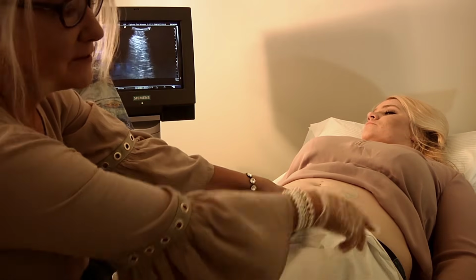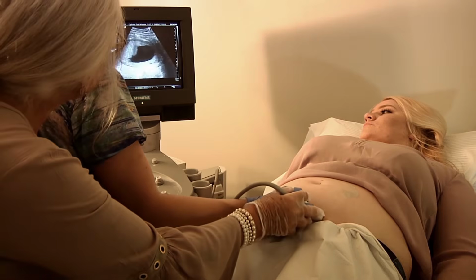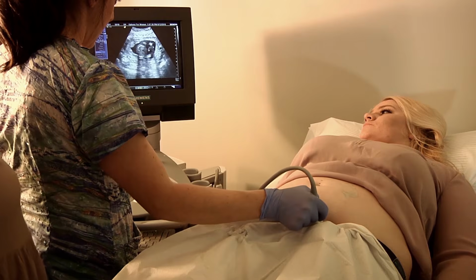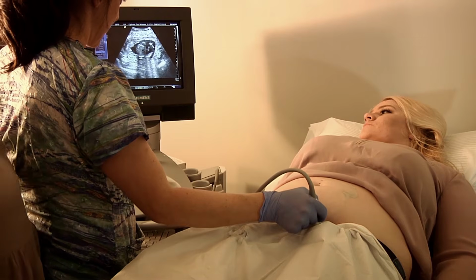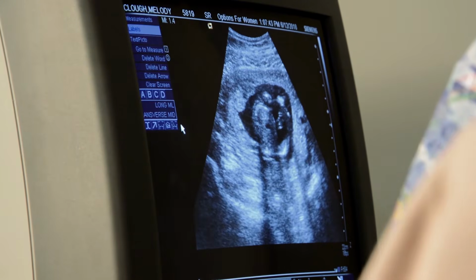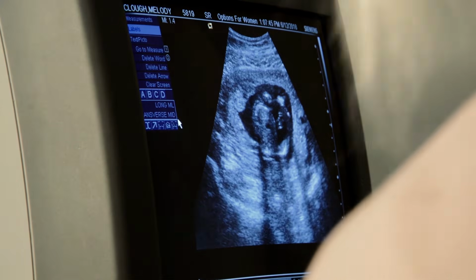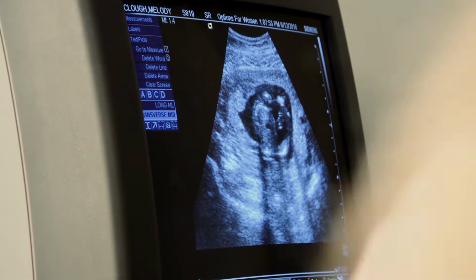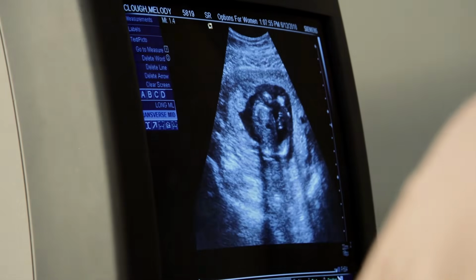And she's backwards, it was on the other. So we'll just go. Good. And then freeze that. And that would be transverse. Did it take it? No. We'll have to figure out why, but this would then be annotation transverse.